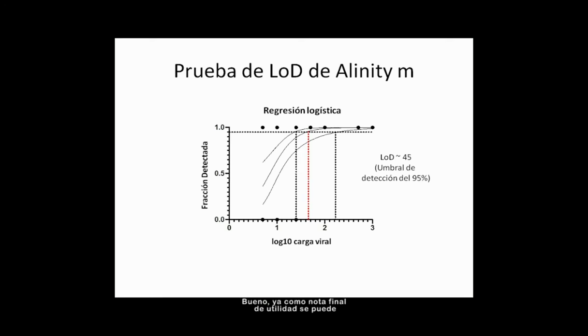And just as one final note of the utility of being able to access the cycle number or cycle threshold values, we're able to use those to support a number of different initiatives in our COVID response. And I'm sure that many of you, like us, had issues acquiring certain supplies needed for sampling patients. So we went into high production to make viral transport media. We made about 3,000 to 4,000 viral transport media tubes a day for quite a long period.